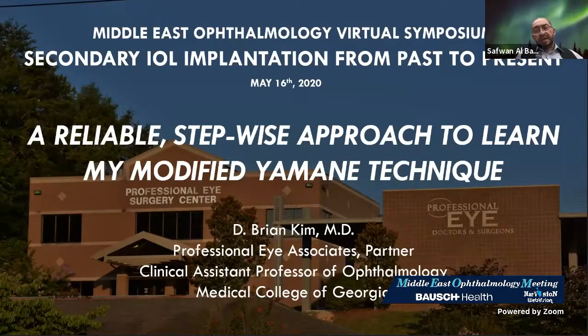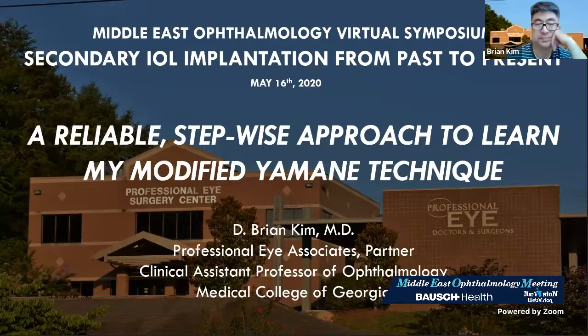But when we say endophthalmitis here, why are we separating it from cataract surgery? What's the difference? I don't know whether Carlos agrees with me and Brian Kim. There's no difference between usual cataract surgery and secondary IOL implantation. It's an implantation, but we are going out and in, so I think the rate will be the same. Safwan, perhaps they refer to the haptic in the sclera having a channel for infection to enter the eye. Yeah, but it's covered by the conjunctiva anyway.